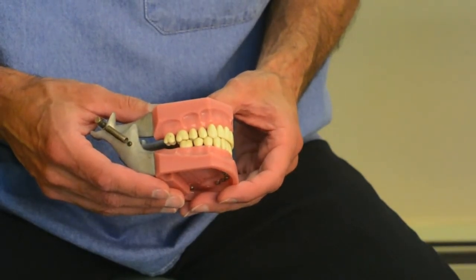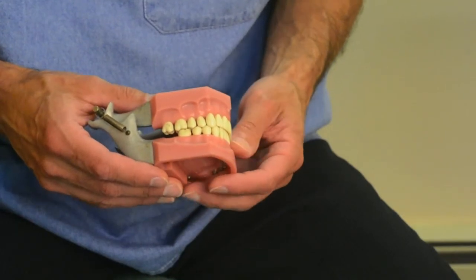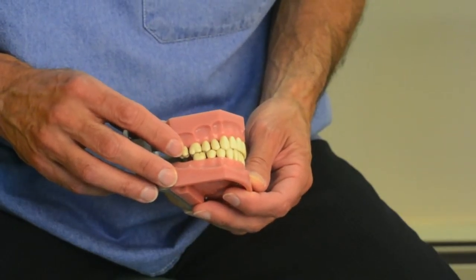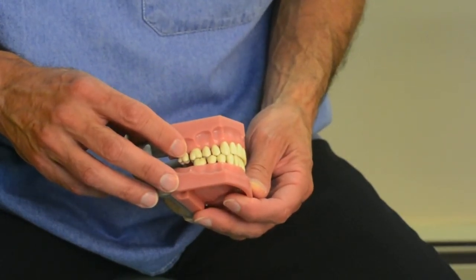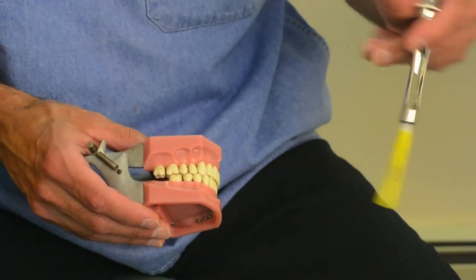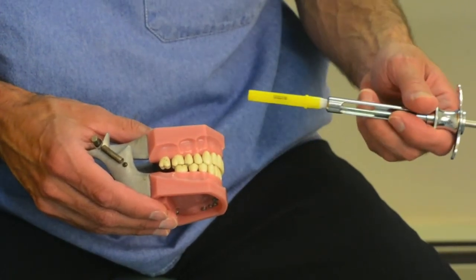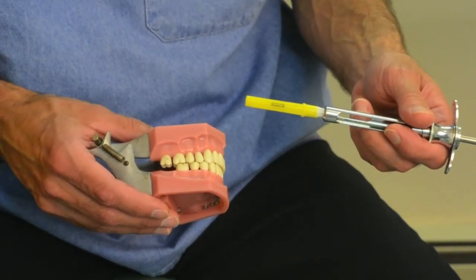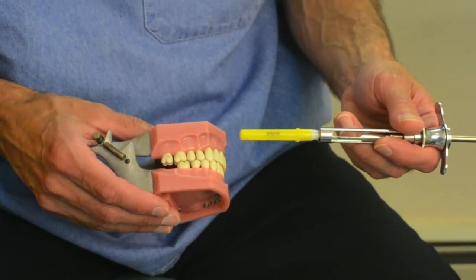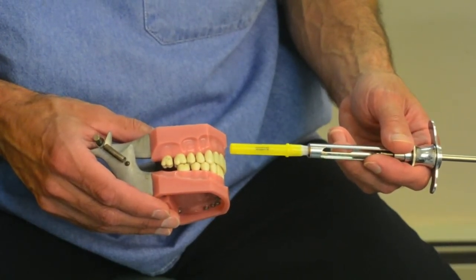When wiring patients' jaws for mandibular fractures, we can't forget that the maxillary teeth also have to be involved in the fixation. Obtaining maxillary anesthesia is a relatively simple procedure — all you need to do is perform local infiltrations over the teeth you plan to involve in the fixation. Just remember to always give a palatal anesthetic injection as well, because wire placements go around the palatal aspects of the teeth and patients will experience pain if you do not anesthetize the palate.